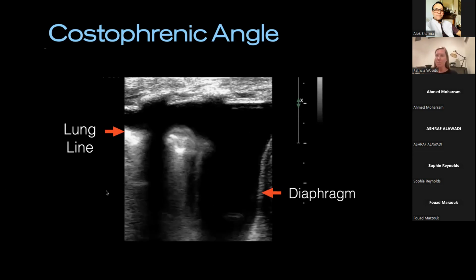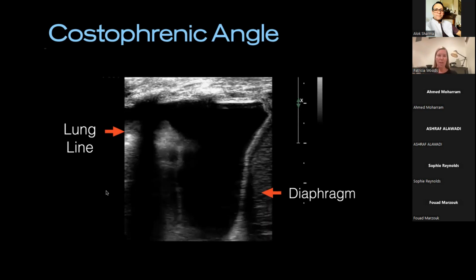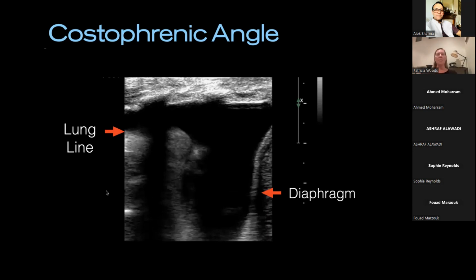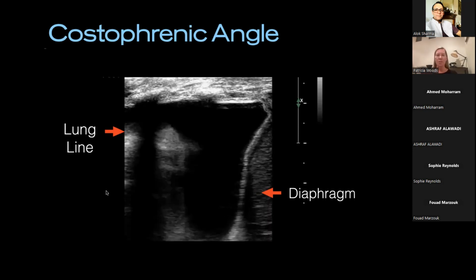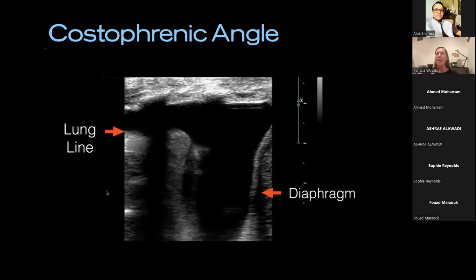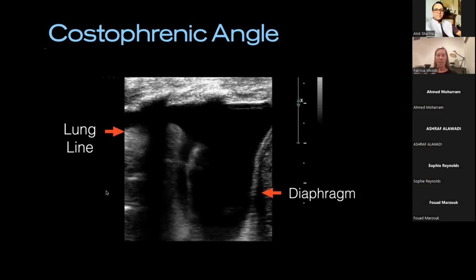And this is when it comes to measurements, if what, so what, which we'll come to in 2D and M mode, but you're just getting an appreciation of the diaphragm activity and the degree of lung aeration below, and then trying to make a clinical decision. Is this something the baby would benefit from draining, and so forth.